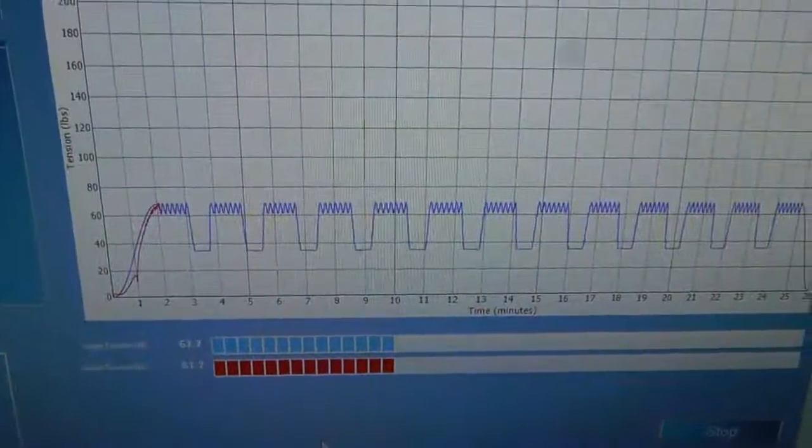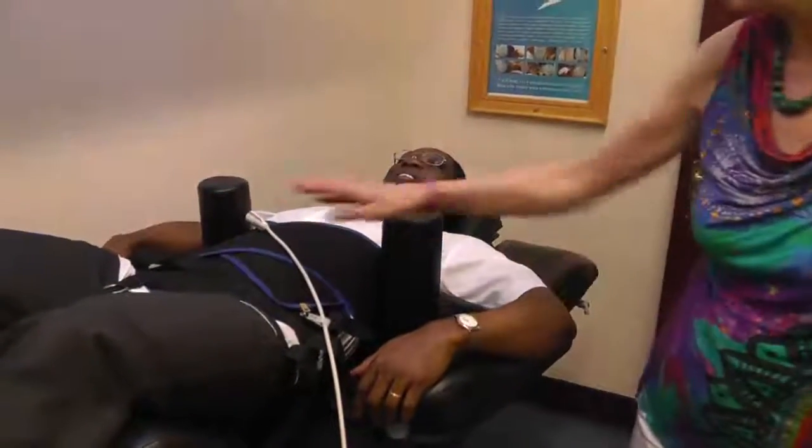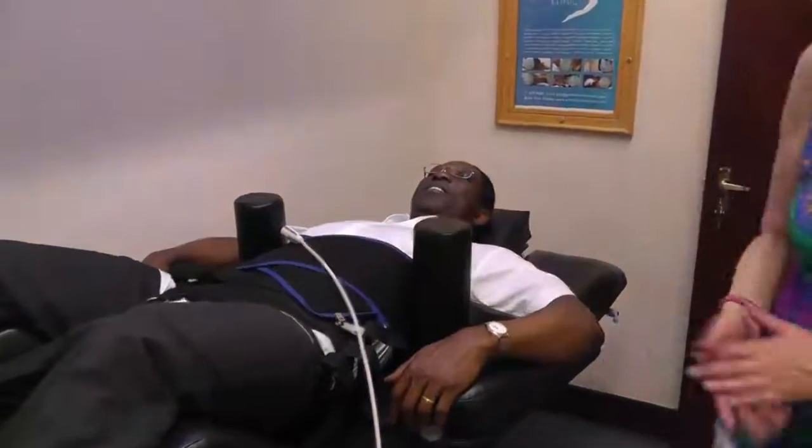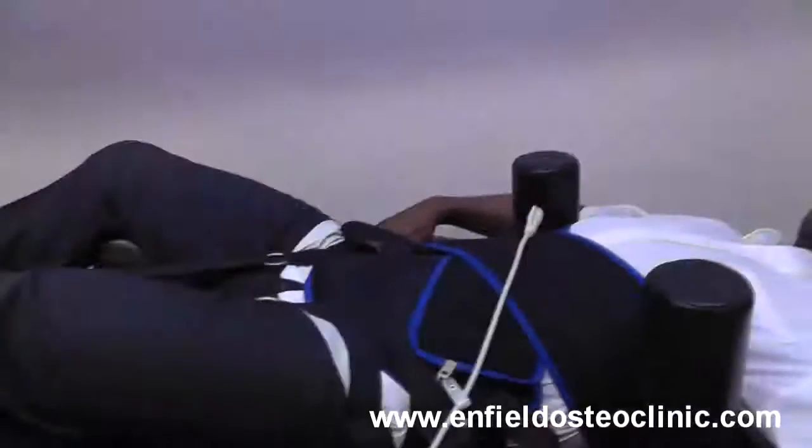This is the force coming on and that's being delivered by this belt which is connected to the ring and then to the harness here. This has to be nice and tight. In a moment we're going to open the bottom half of the table so he'll get an even bigger stretch. So how are you feeling John? Very good, quite comfortable actually. You're just in the first minute so far.